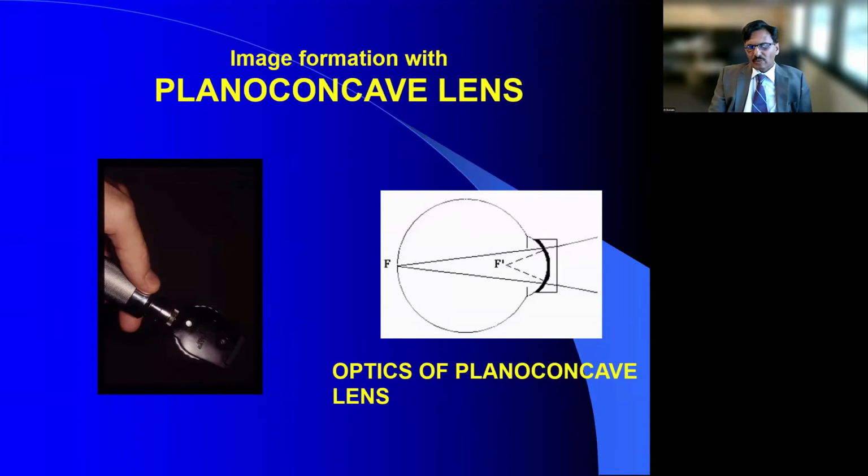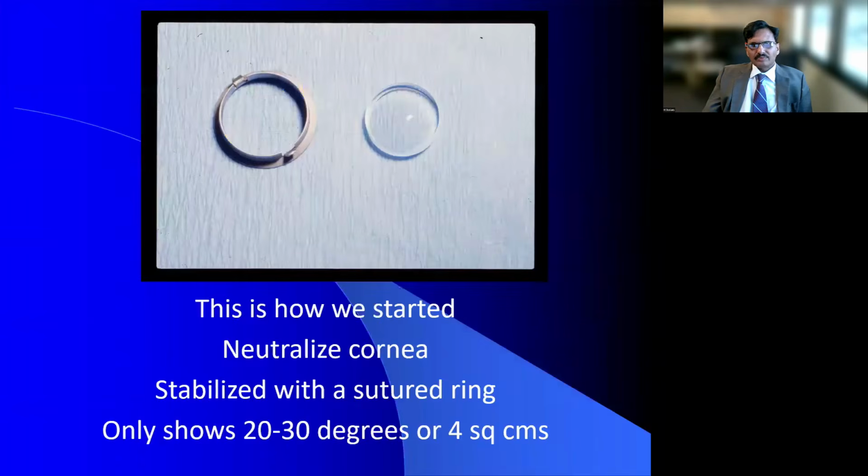Of course, this is useful because the stereopsis in this particular mode is extremely good. So if you're really doing anything close on the optic nerve or a macula, like a macular hole or an epiretinal membrane, a flat lens has much better light transmission as well as much better stereopsis, which is really crucial if you're peeling thin membranes and judging their depth. So 50 odd years ago, when vitrectomy started, this was the only thing that people had access to.